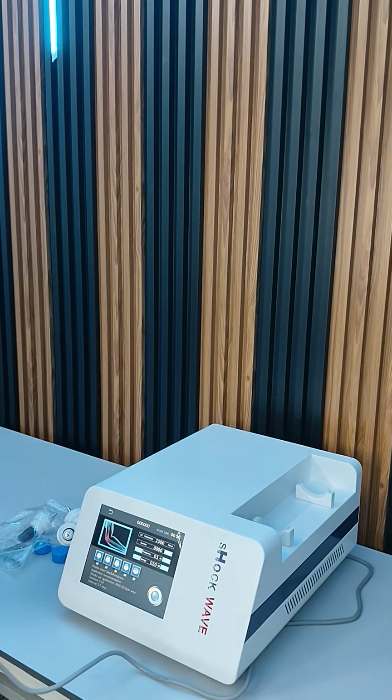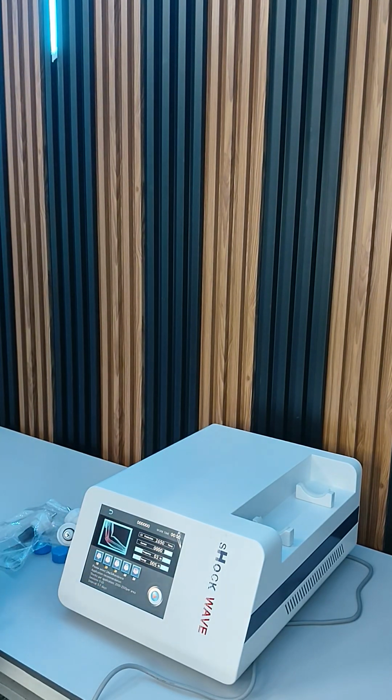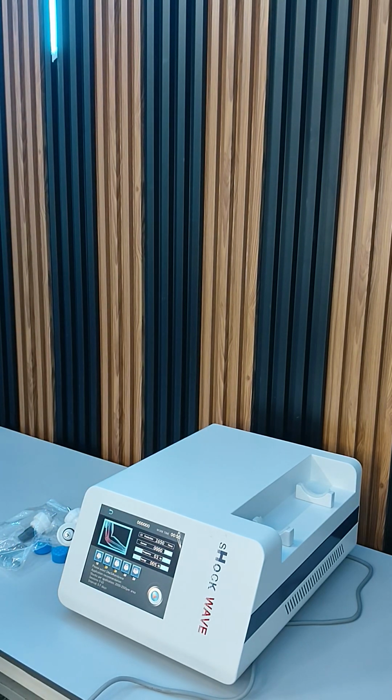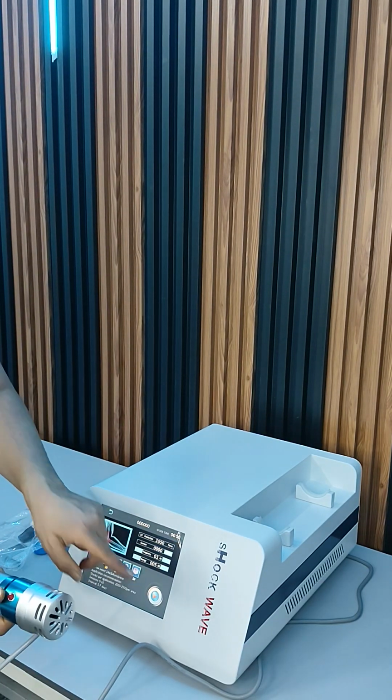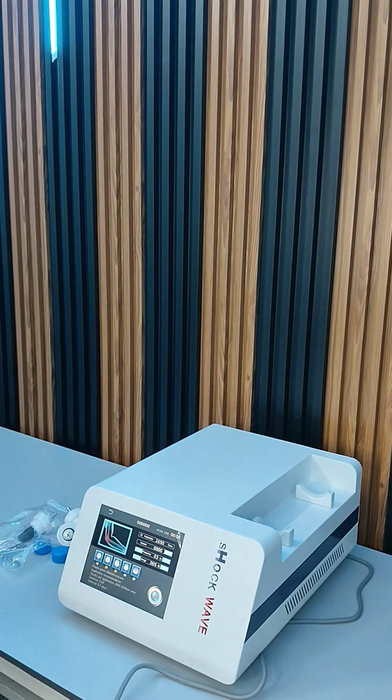I have selected frequency 3, and I will select the minimum energy, and these are the number of selected shots. I can increase that up to 5,000. When I select 5,000, I will start the treatment. It will keep on counting, and once it reaches 5,000, it will automatically stop the treatment. Or you can stop it in between by pressing this button, as well as the one on the handpiece. When the patient feels discomfort or the applicator might slip off, you can stop in between. If the doctor wants to stop the treatment, he can press the switch.